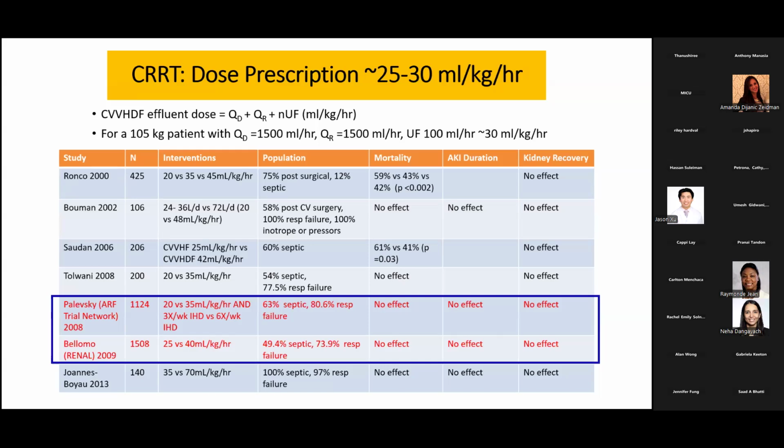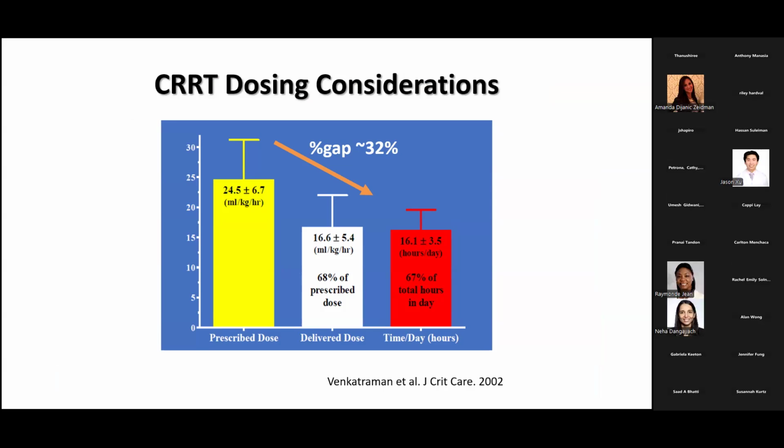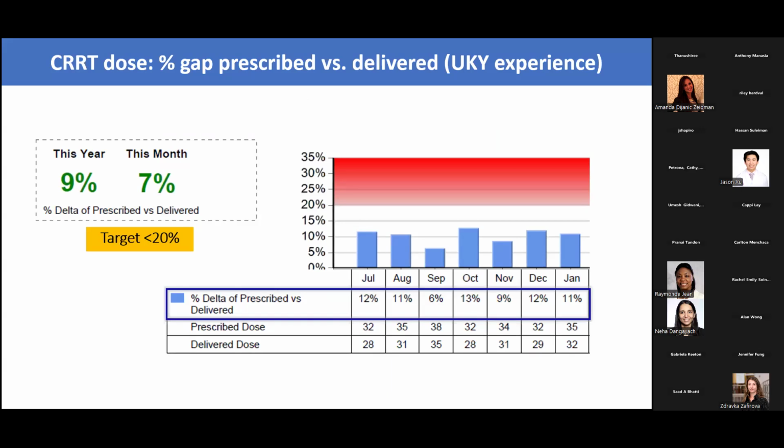So the same practice we can incorporate into fluid management, right? The first time, 20 years ago, when the gap between what you prescribe in terms of dose and what you actually deliver to the patient was evaluated, there was a gap of 32%. I can tell you what we prescribe in fluid management and what we achieve on average on all the patients, it's a gap much more than 32%. And I can guarantee you that happens in every practice because we don't have enough tools to monitor the patients and to intervene timely, right?